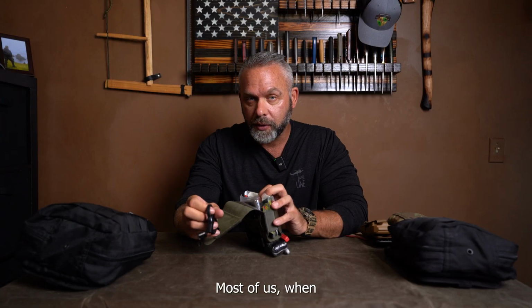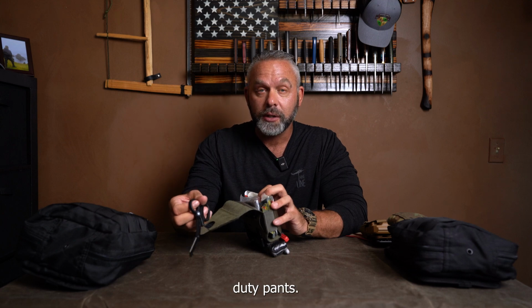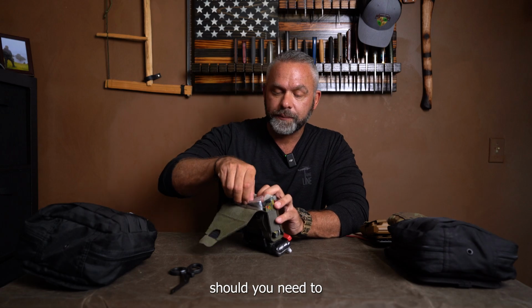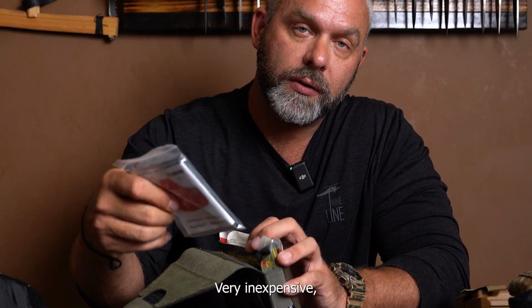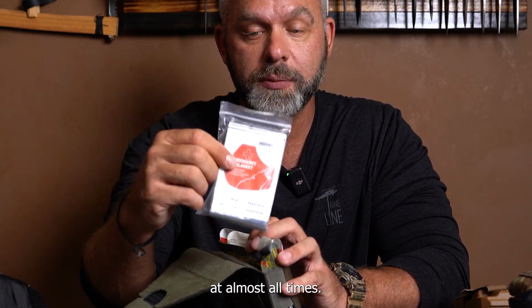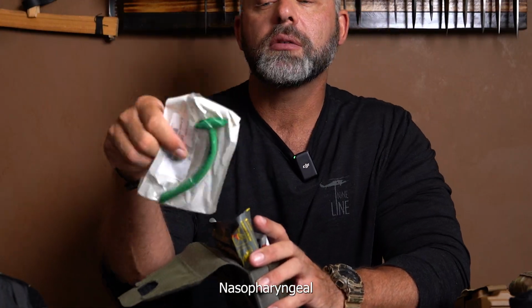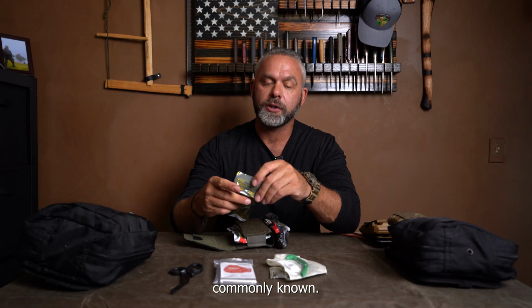Shears. Most of us, when we're out there, you're out in the bush, you're training, you wear some pretty heavy duty pants. You need to be able to cut through those pants, or a shirt should you need to. If you're losing core temperature, very small, very lightweight, very inexpensive, but necessary to have on you at almost all times, especially when you're training. You have a Mylar emergency blanket to retain your own body heat. Nasopharyngeal right here with some lubricant, or the nose hose, this is what's more commonly known.